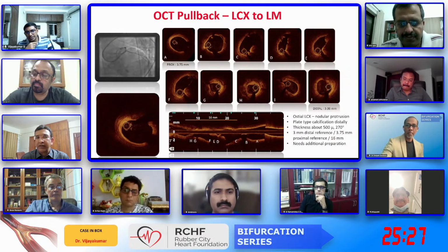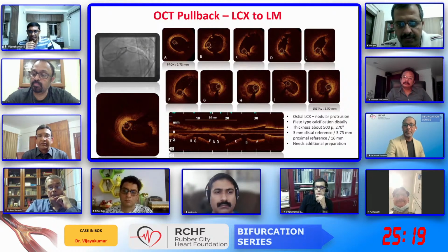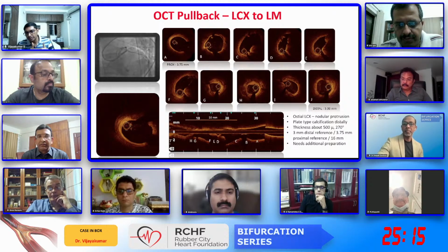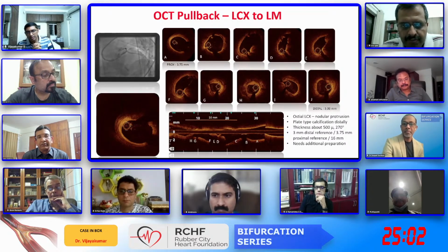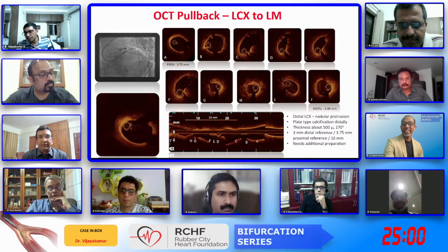This recent study has shown, I think it has been presented, that it works in nodules, but not to the same extent as in circumferential calcium. It is almost like an eccentric calcium. It works. So they say that compression, how much compression you achieve with it. They say that the top part is friable. You can just compress with your balloon or IVL. So that is when you get a D-shaped stent expansion, but still it is adequate stent expansion. So unfortunately, Vijay, we didn't have both.